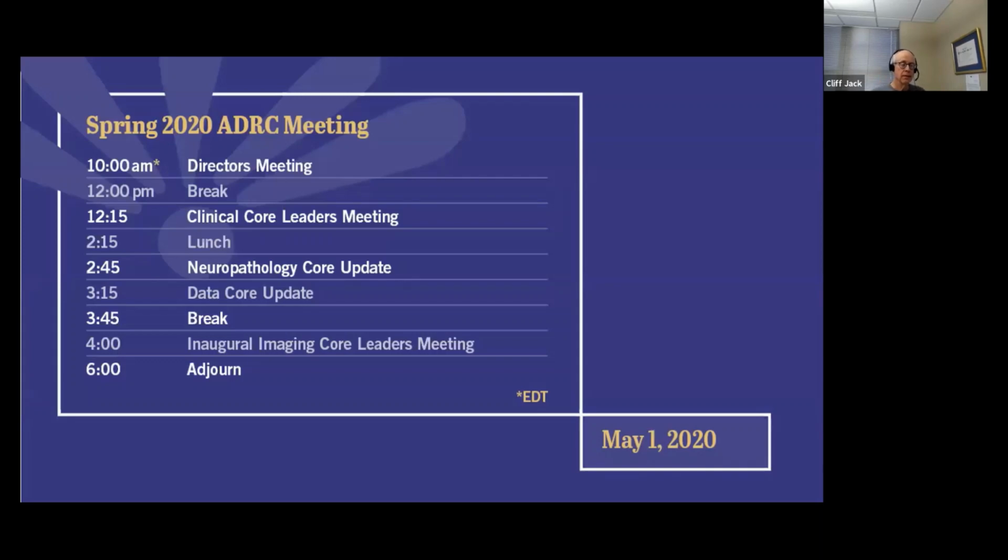it does make sense for SCAN to qualify two scanners, A and B. The cohort that you've had on scanner A, keep it on A. The cohort that you have on scanner B, keep it on scanner B. But we do keep track of what scanner each exam is done on. There's a serial number embedded in the DICOM header, so it's not a secret. We know what's going on, and we would say keep the people who've been scanned in your cohort on scanner A on that scanner, and likewise on scanner B.